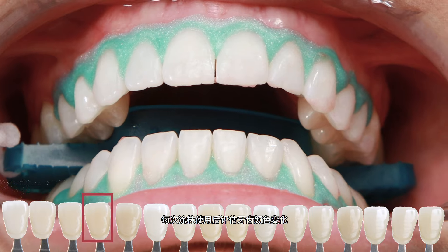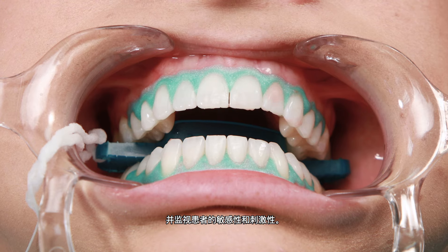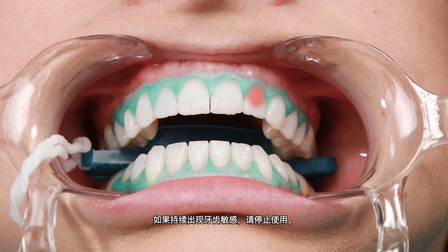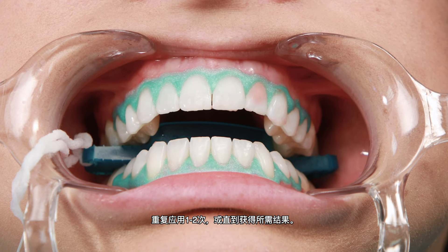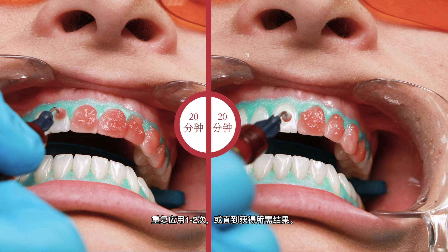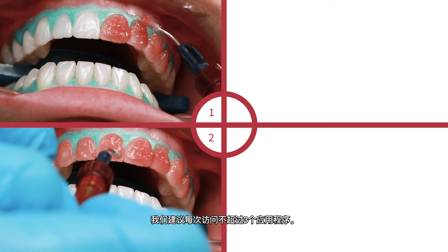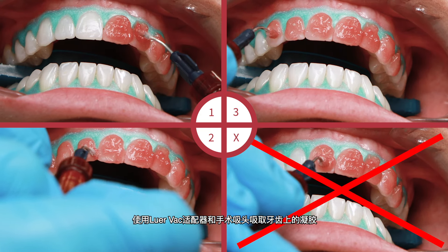Evaluate shade change after each application and monitor patient for sensitivity and irritation. If persistent tooth sensitivity occurs, discontinue use. Repeat application one to two times or until the desired results are achieved. We do not recommend exceeding three applications per visit.